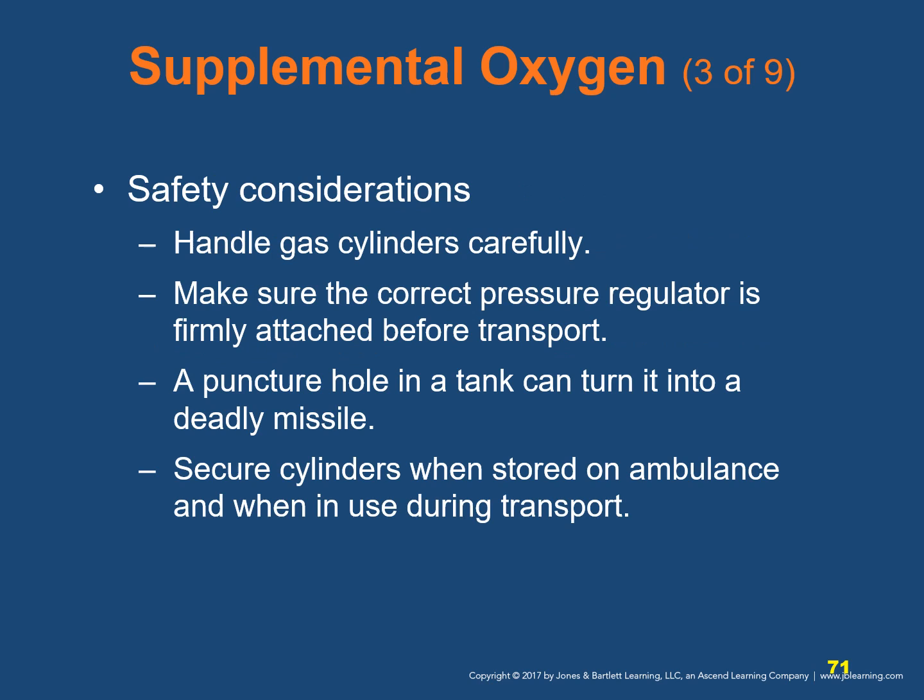Now, liquid oxygen is becoming more commonly used as an alternative to compressed gas oxygen. Liquid oxygen containers tend to be more expensive than compressed oxygen tanks, hold a larger volume, and therefore do not need to be filled as often, weigh less than aluminum or steel tanks, need to be kept upright, and have special requirements for filling, large volume storage, and cylinder transfer. People who receive long-term oxygen therapy use liquid oxygen units.